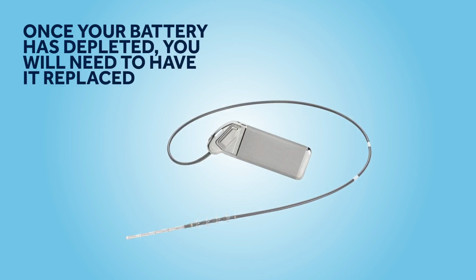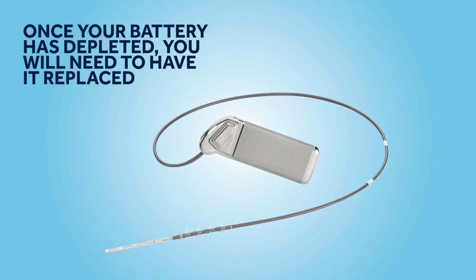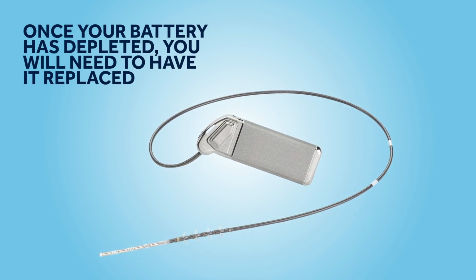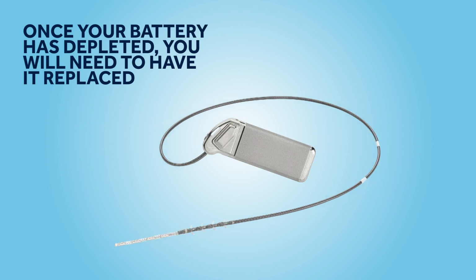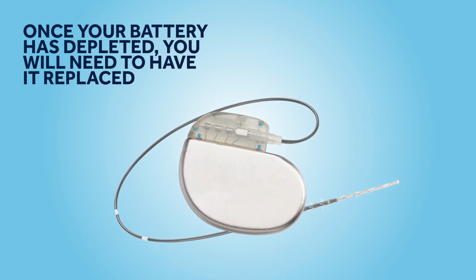Your lead is designed to stay in position for the rest of your life, but the battery will at some point need to be replaced. How frequently this is required will depend on what sort of battery you have. The replacement procedure involves a hospital visit and a minor surgical operation.